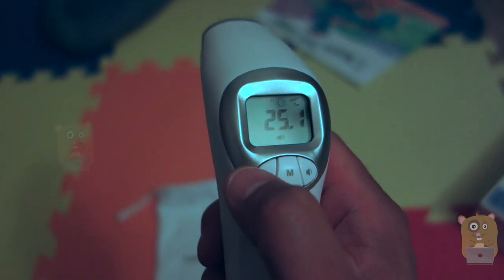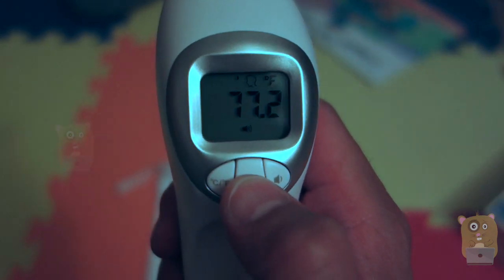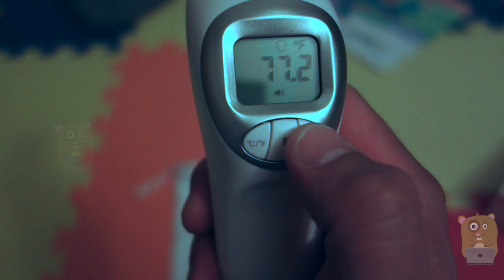I can change between Celsius and Fahrenheit, and I'll change the mode. So currently it's measuring body temperature — now it's measuring surface. I'll switch it back to body temperature. I can also turn off the beep if I want to.